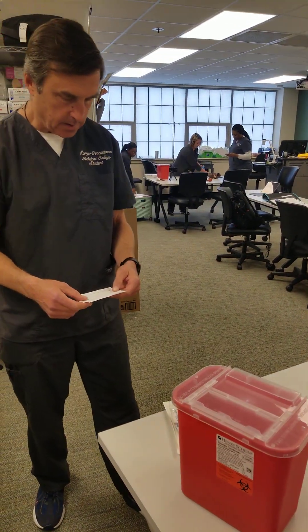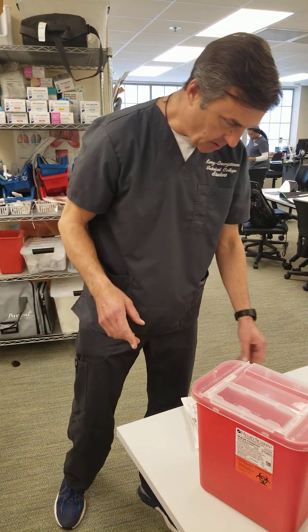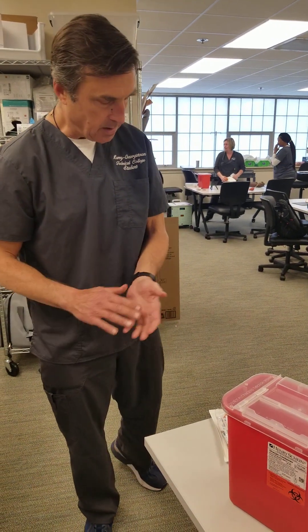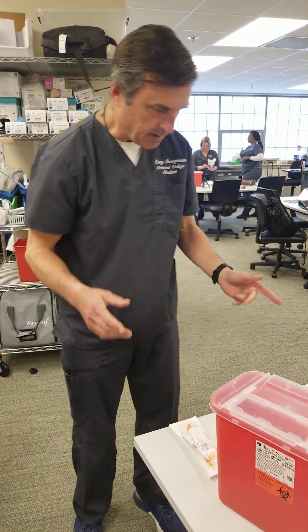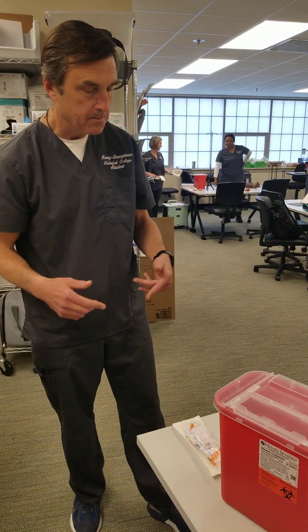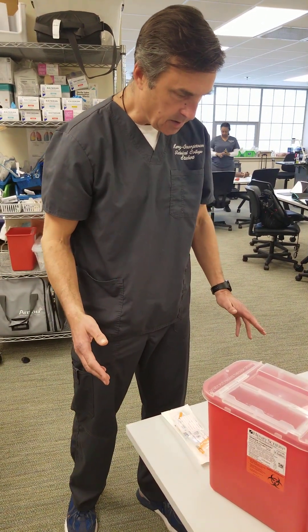I've been ordered by the doctor to give Mr. Johnson an ABG — that's the indication. I'm going to gather my equipment first, my ABG kit, and I'm going to check this chart for any allergies, any abnormalities in platelet count. No contraindications there.